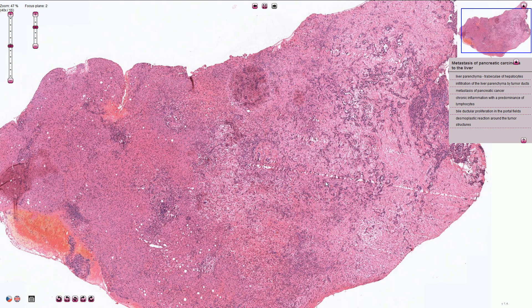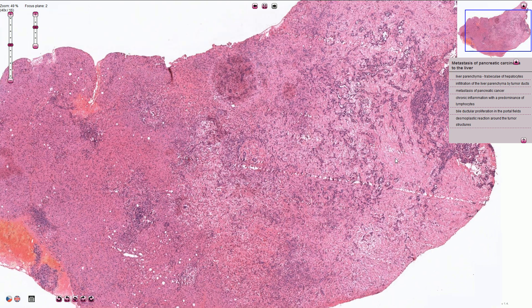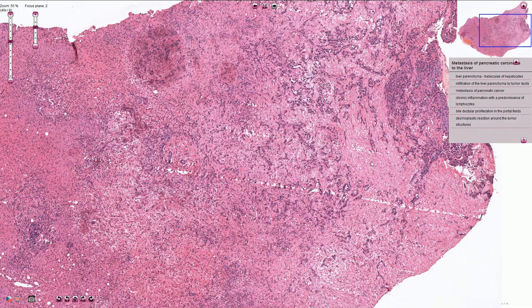Most pancreatic adenocarcinomas have a prominent fibrous component, and that is what we can see here.